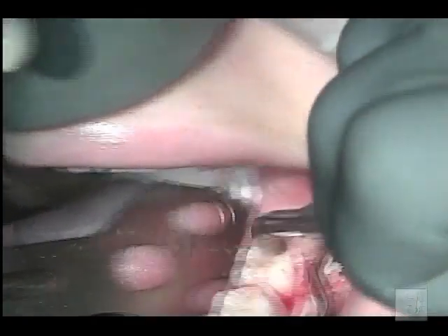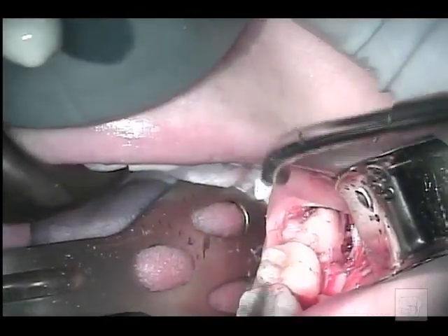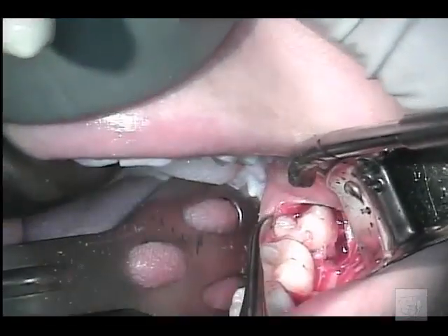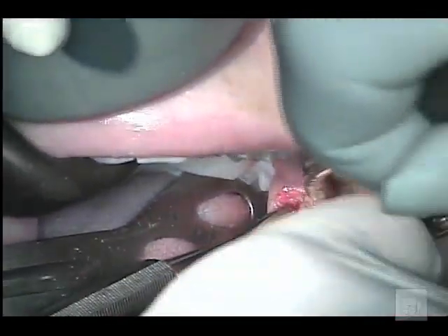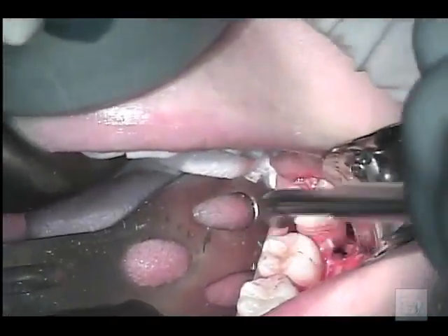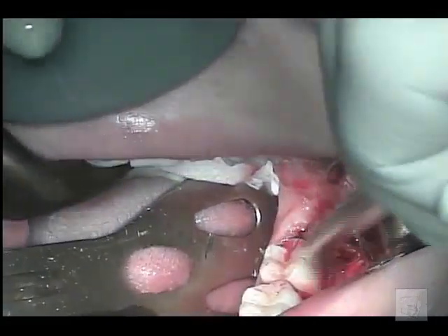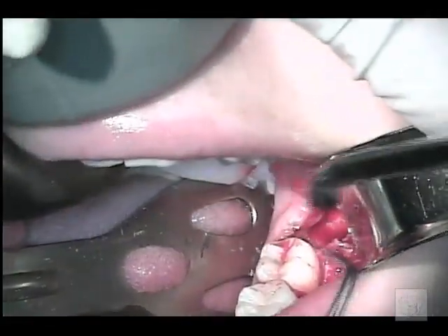Once you've removed all the bone, you try to elevate the tooth, and you see that it does move very freely. However, there's soft tissue covering the lingual aspect of the crown, and so you can use a periosteal elevator to retract those soft tissues out of the way, and you can see that the tooth elevates out very easily. You can then just grab it with a small hemostat and remove it.